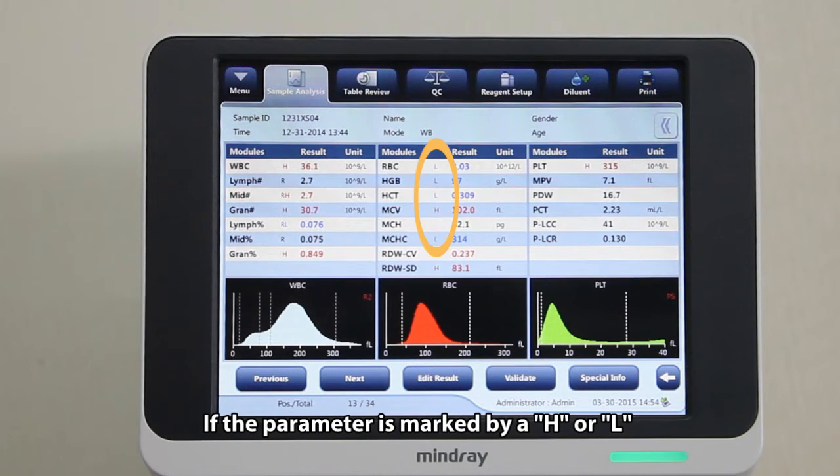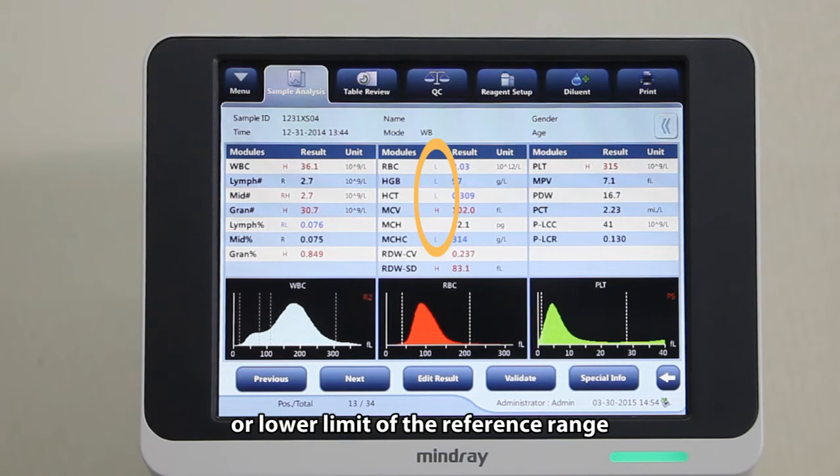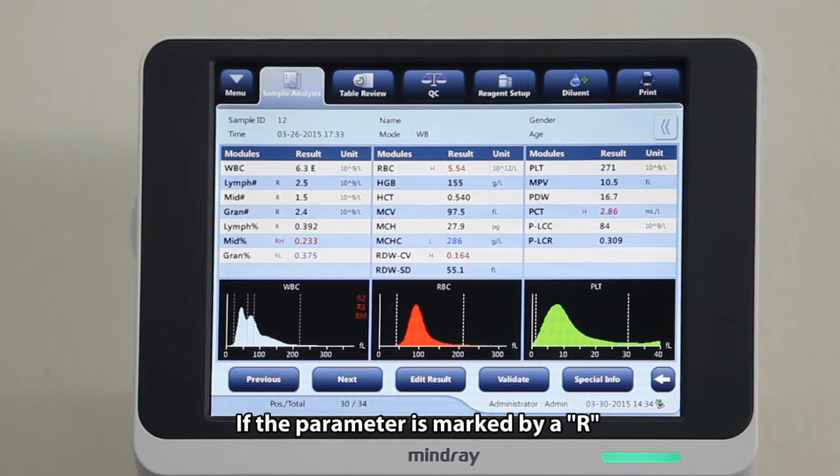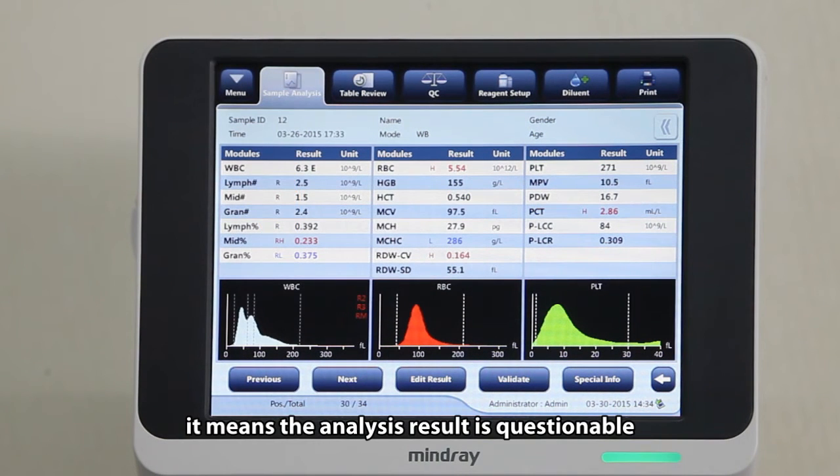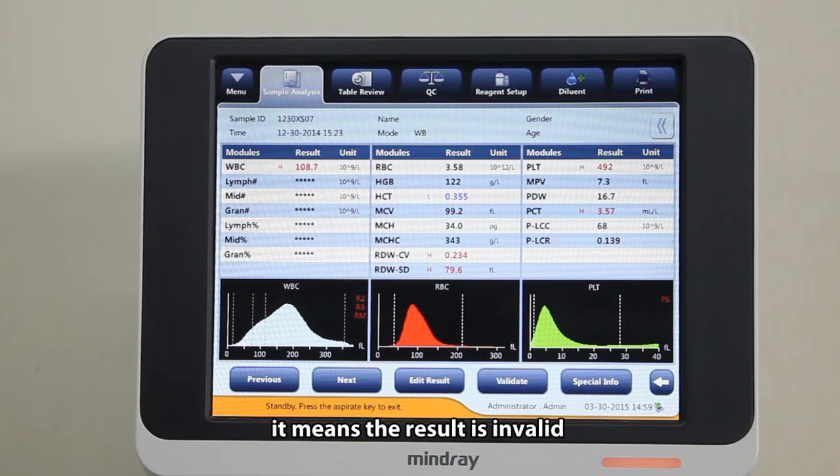If the parameter is marked by an H or L, it means the analysis result exceeds either the upper or lower limit of the reference range. If the parameter is marked by an R, it means the analysis result is questionable. If you see five asterisks as opposed to the result, it means the result is invalid.